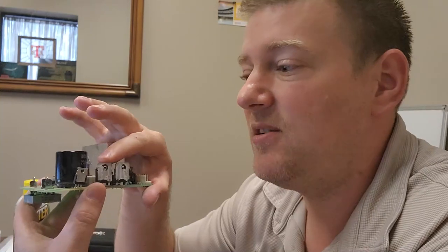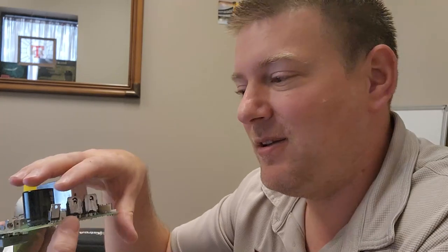Now, the symptoms that I had are, I could hear the SCRs running, and these here are the SCRs. These are actually the powerhouse that chop up the pulse width modulation for the motor. So it is a two-pole DC motor, and it runs off some high voltage. I measured at the voltage terminals for the motor right here, at these two motor terminals, and I got 0 volts. Well, I found out why. It was a very good reason.